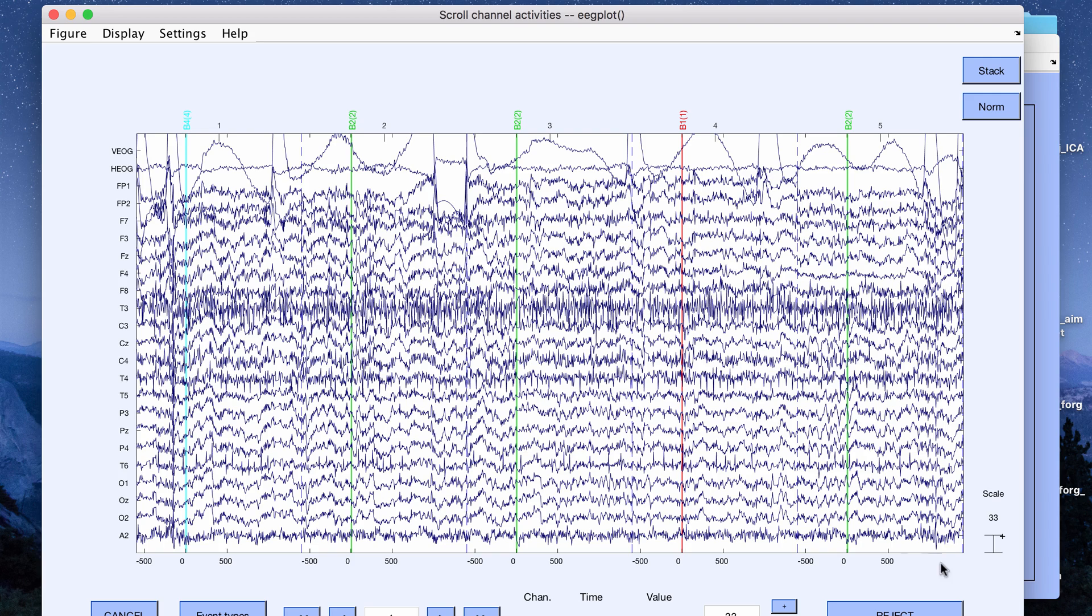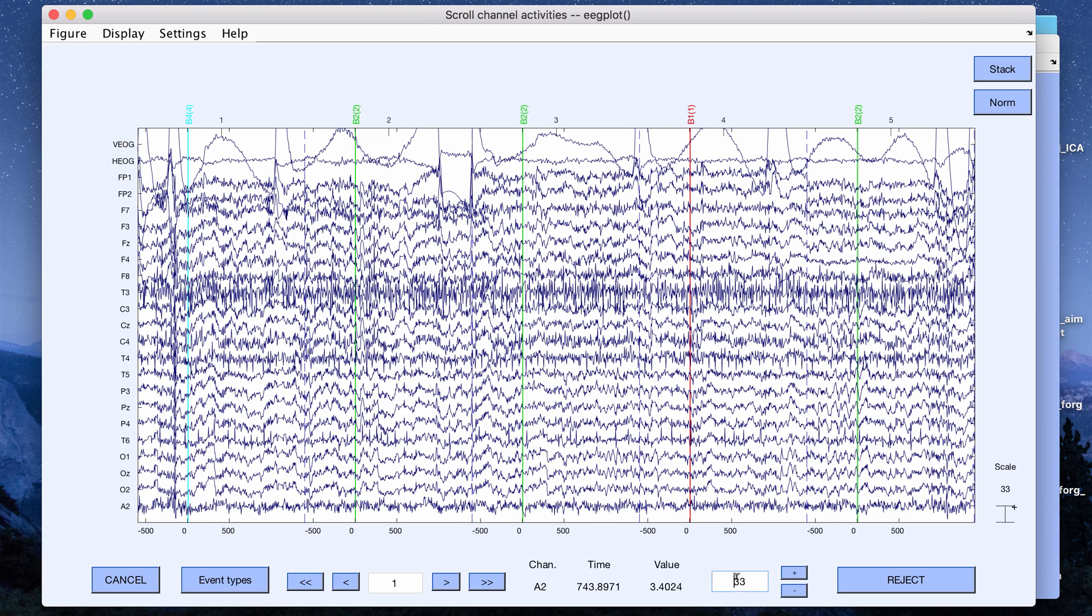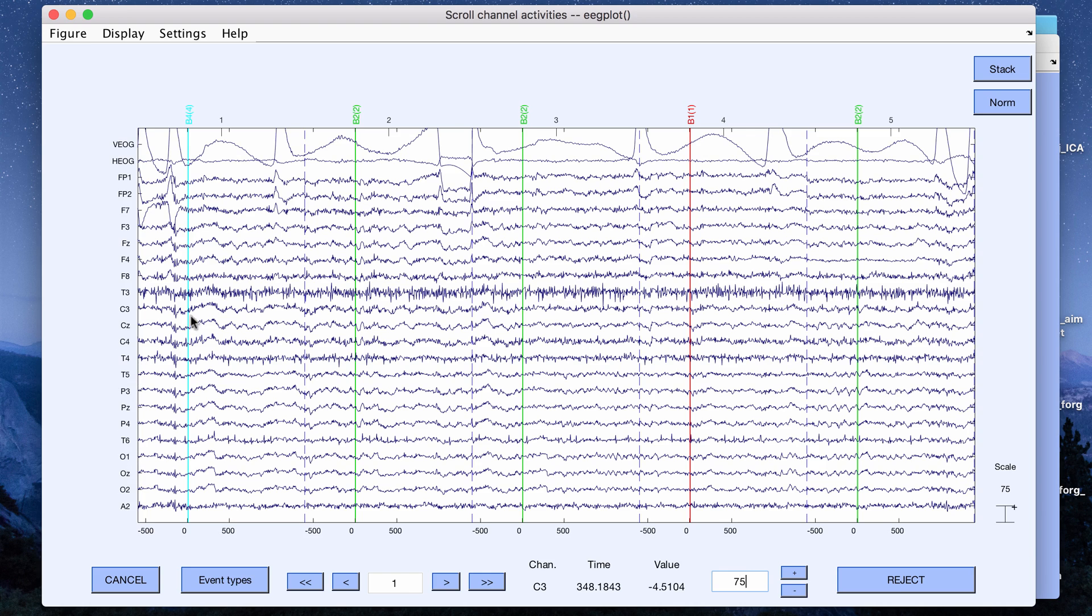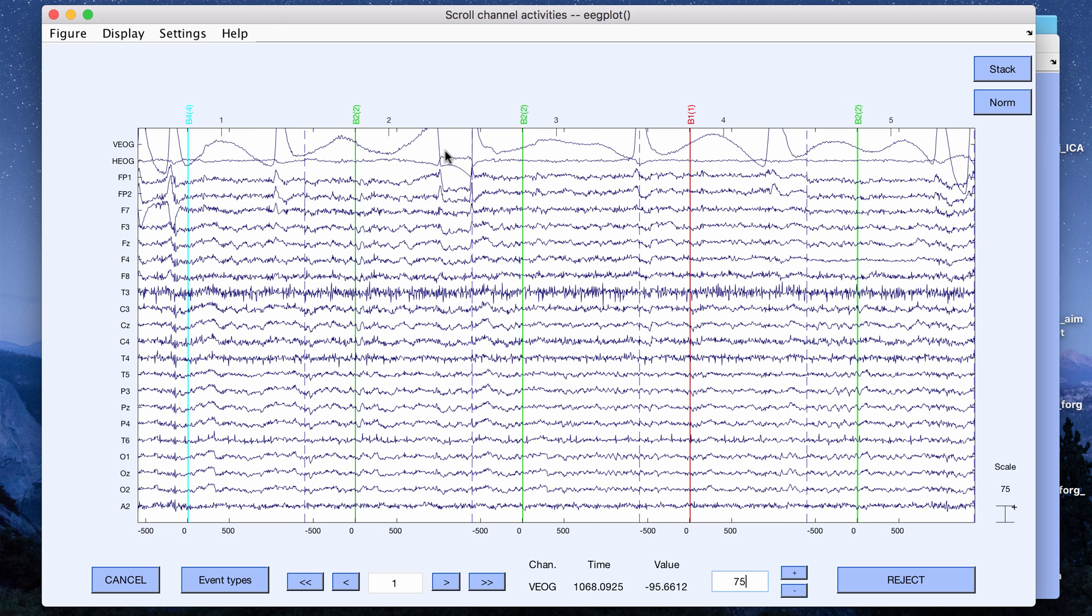For this subject, let me change the scale to 75. We have two eye electrodes. We have one capturing vertical EOG which will capture blinks and we have one capturing horizontal eye movement that will capture saccades.